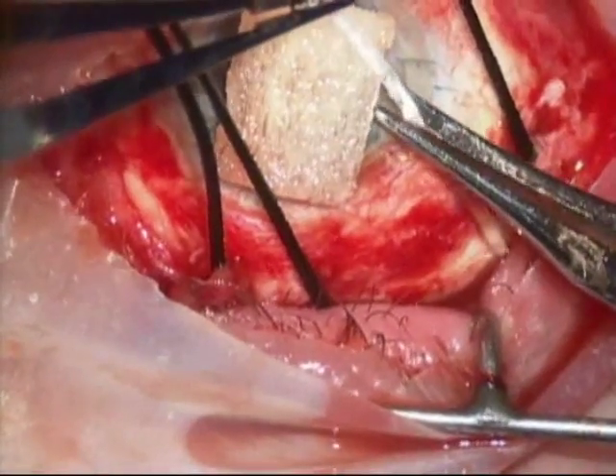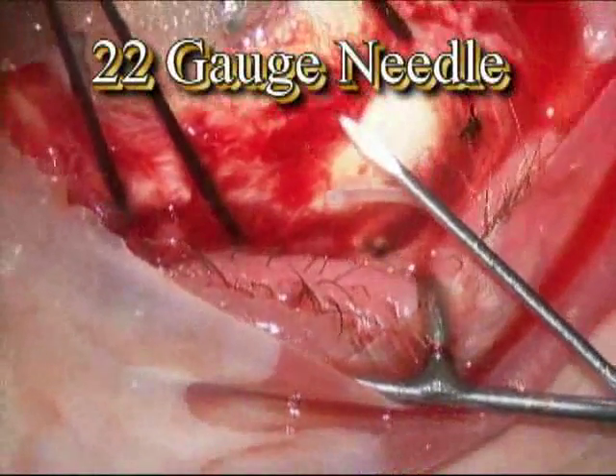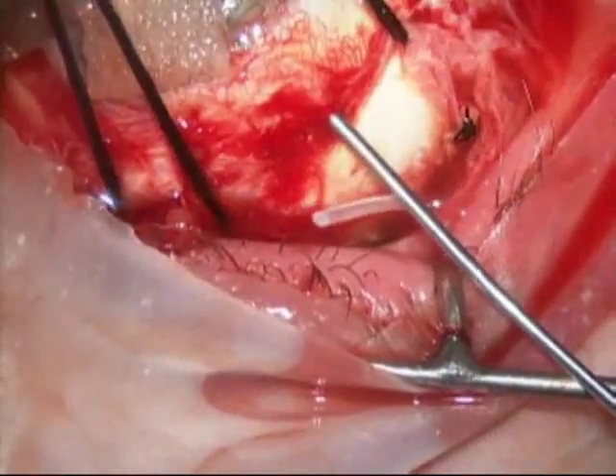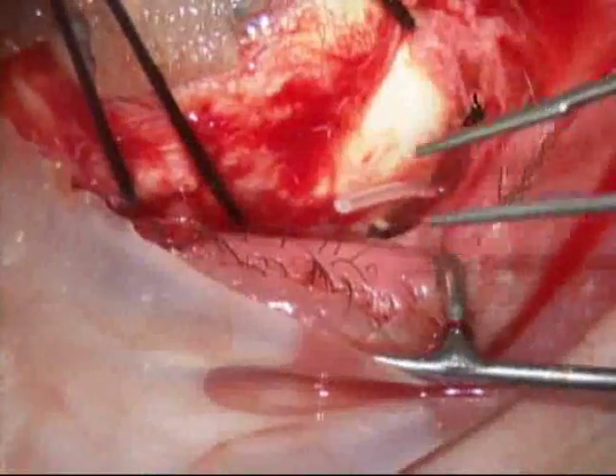Next you'll see the valve tube is trimmed, and then finally a 22 gauge needle is used to make a hole in the globe so the tube can be placed into the globe through that hole.